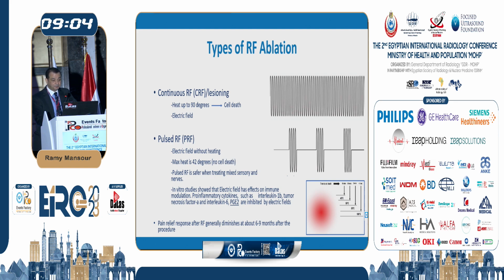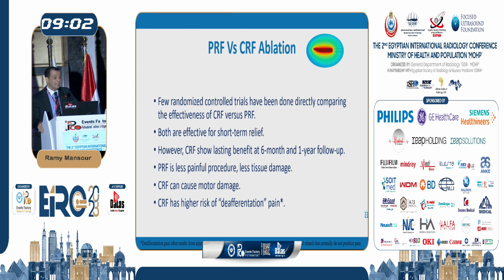And you can see from the studies that there are no controlled studies that can tell you the efficacy of one compared to another. However, it's been known and agreed that if you use continuous radiofrequency, it produces a longer period of pain relief. You can see at 6 months and a year, there is more reduction. However, pulsed is safe. Actually, there are no known side effects of pulsed radiofrequency ablation.